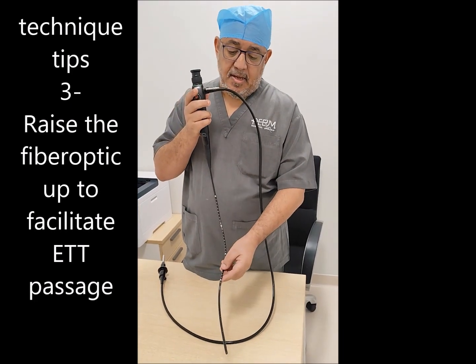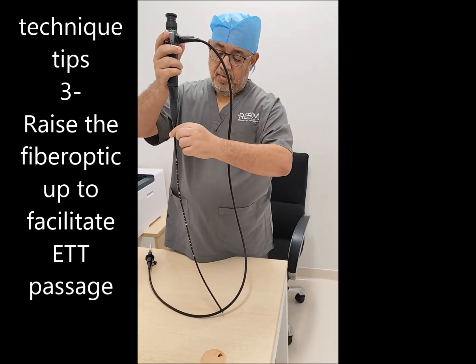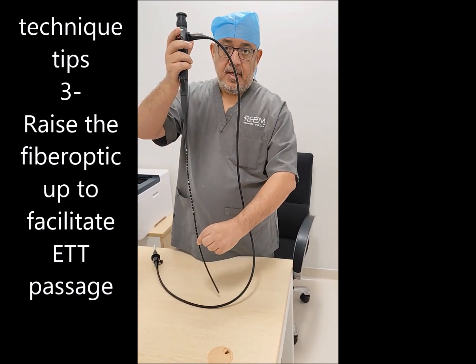After the fiber optic passes through the vocal cords, raise your hand up to straighten and simplify the path of the tube so it can advance smoothly.